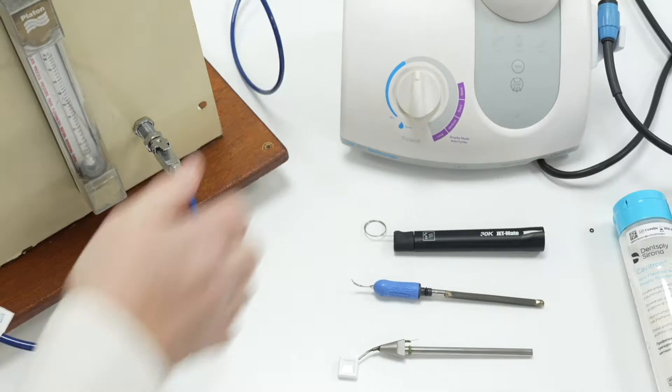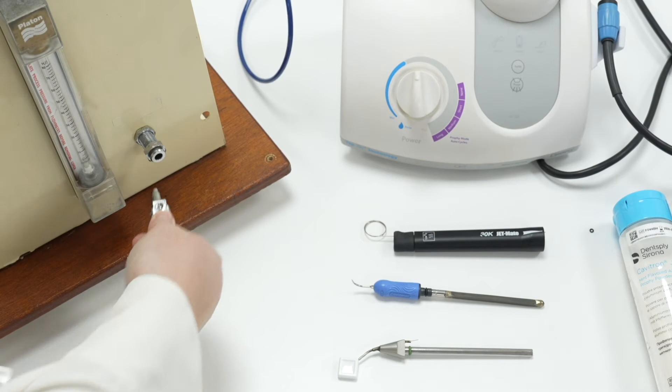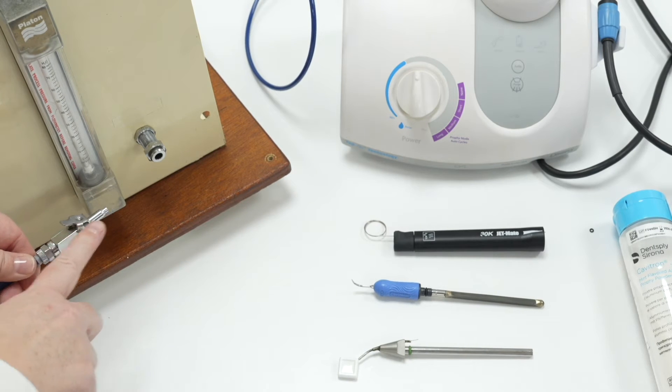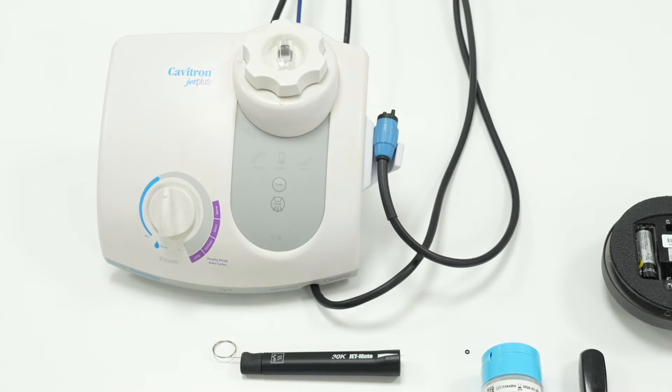To take these lines out firstly disconnect the male ADEC connector and the female ADEC connector and then simply press down the ring to release the line and pull the line out. To switch the Cavitron Jet Plus on the button is underneath the front of the unit.